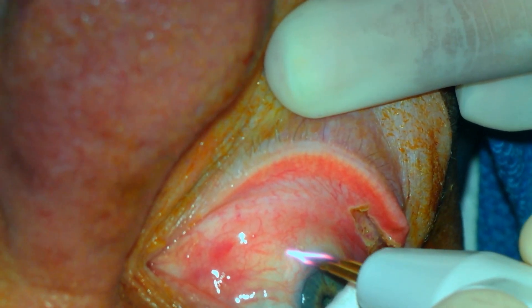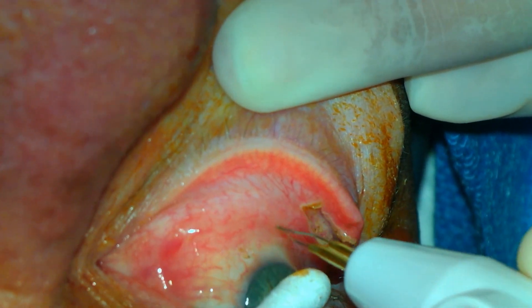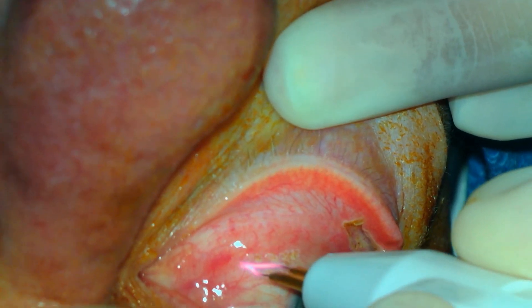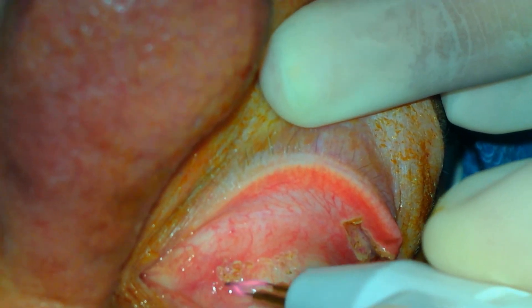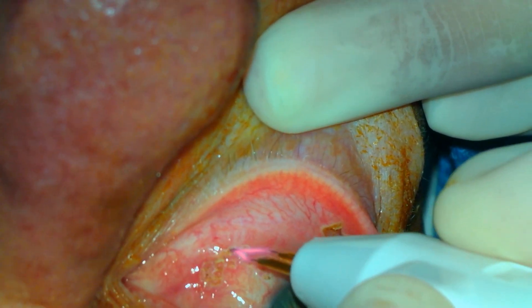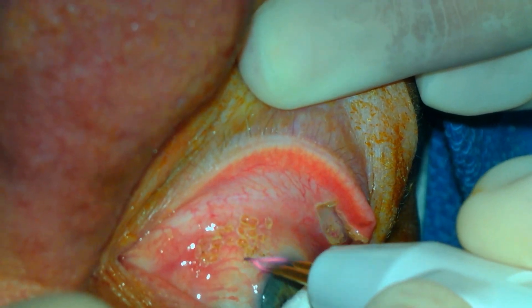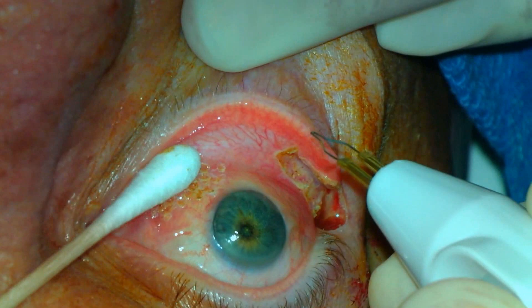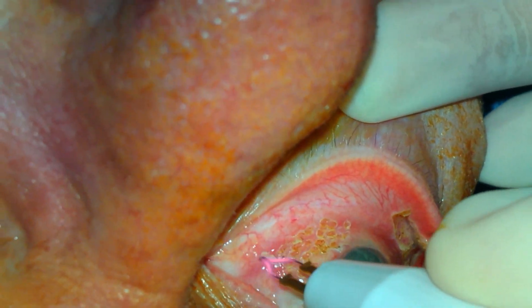A subconjunctival injection of lidocaine with epinephrine has been given and topical anesthesia has been applied. The thermal cautery is then applied to the surface of the conjunctiva in the area of the conjunctival chelasis. The area of redundant conjunctiva has been identified preoperatively and is diffusely addressed with the thermal cautery. This results in a superficial injury of the conjunctiva, which will contract with tissue healing and re-epithelialization.